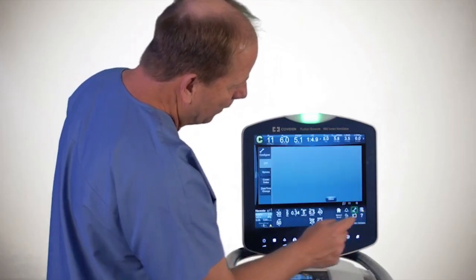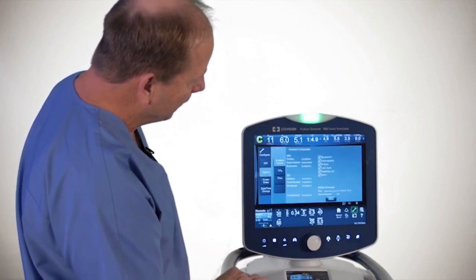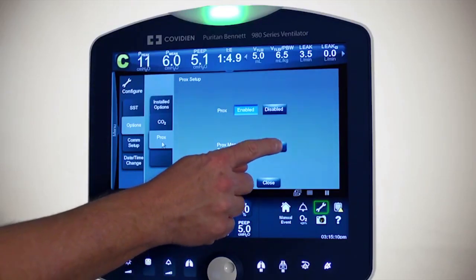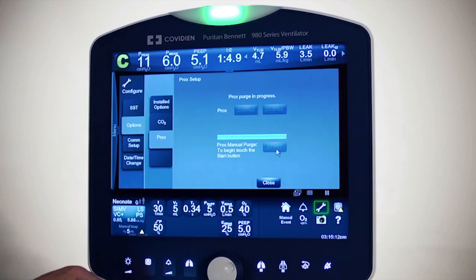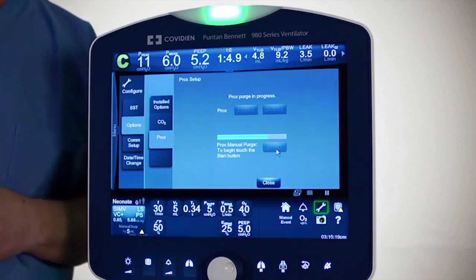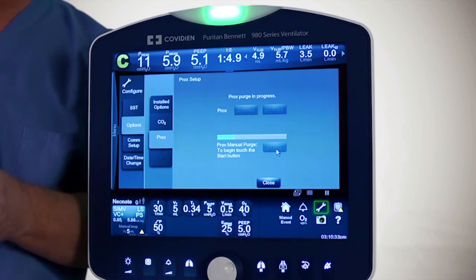If we go into the wrench and touch options, you have a couple of things you can do. For ProxFlow, you can start a manual purge. When a manual purge is done, you'll see the graphics change a little bit — it kind of looks white. Right now it's doing a manual purge. Purges are done during exhalation so they don't affect the inspired volume.